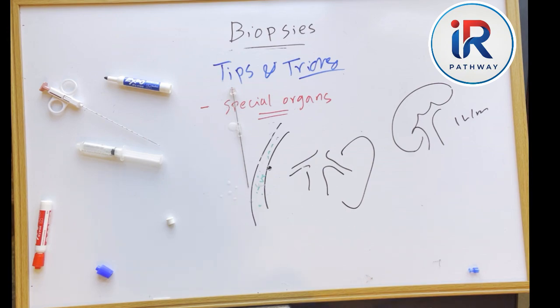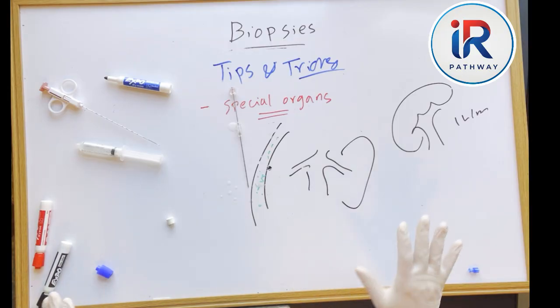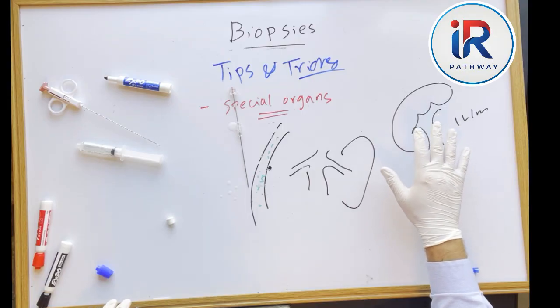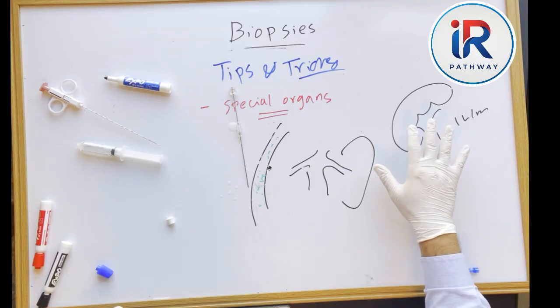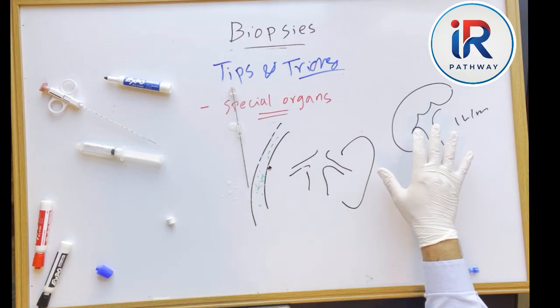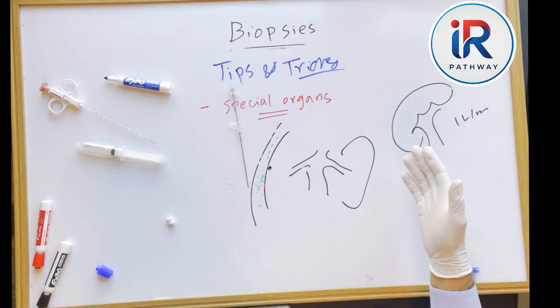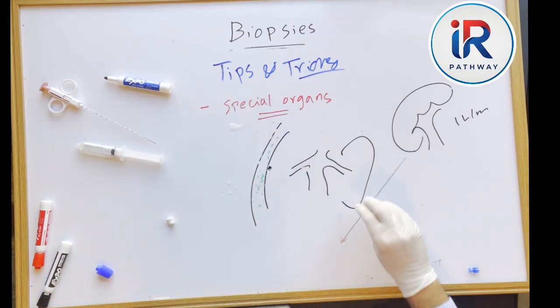My advice is that if you have never performed biopsies before, don't start with kidney biopsy without experienced supervision, as the amount of bleeding can sometimes be scary and intimidating, especially for beginners. But this is the nature of the organ. It's very vascular, so bleeding is expected. Now, how do we deal with this bleeding, which is likely to occur? There are several options or approaches.